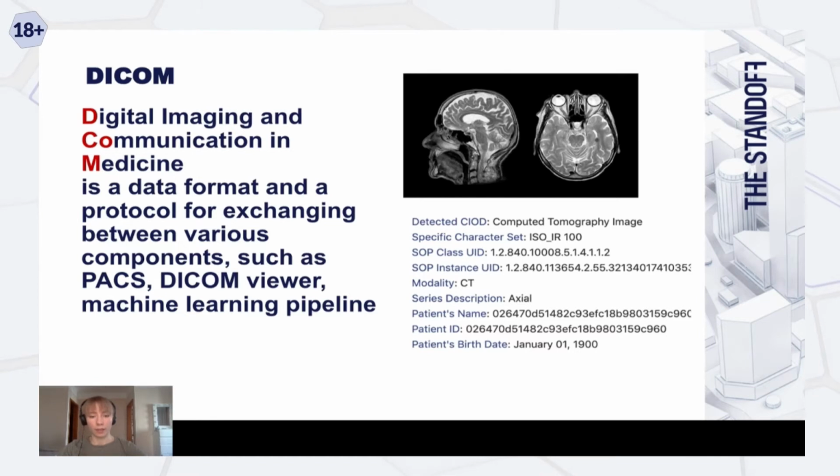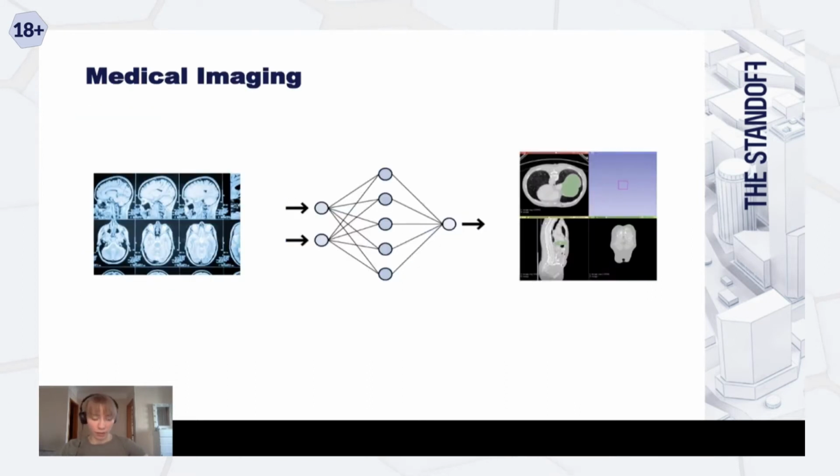The second part of the protocol describes the DICOM format as it is on the disk. On the slide, you can see an example of a DICOM file. Each DICOM file contains the main information about the patient, like the patient's name, and the complete investigation.